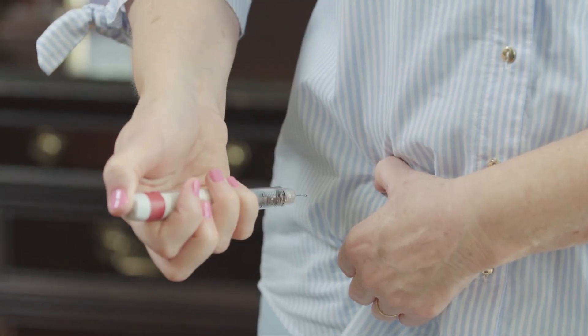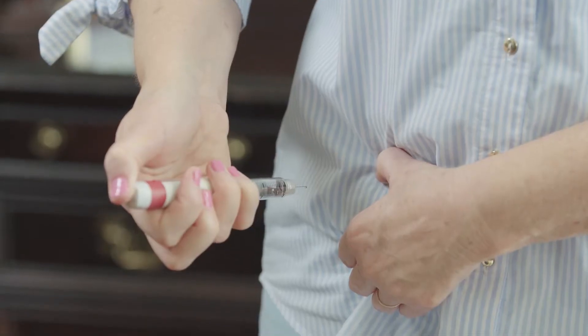Once everything has been administered, you are going to count slowly to five — one, two, three, four, five — and then pull straight out.